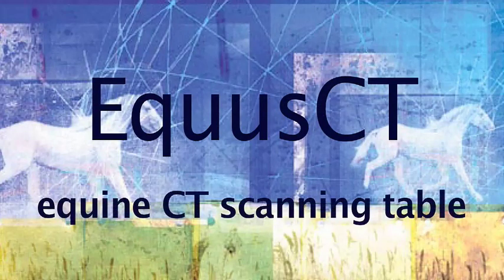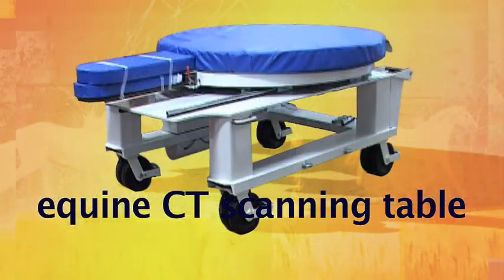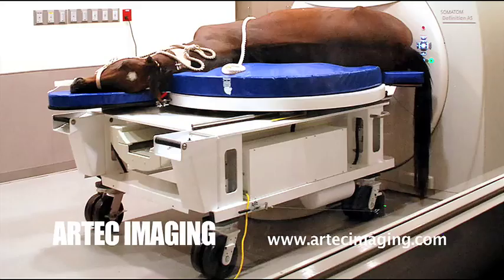Introducing the Equus CT Equine CT Scanning Table. The Equus CT offers second-to-none ease of use and functionality and makes the CT scanning of horses and other large animals an effortless procedure for veterinarians practicing equine health care.